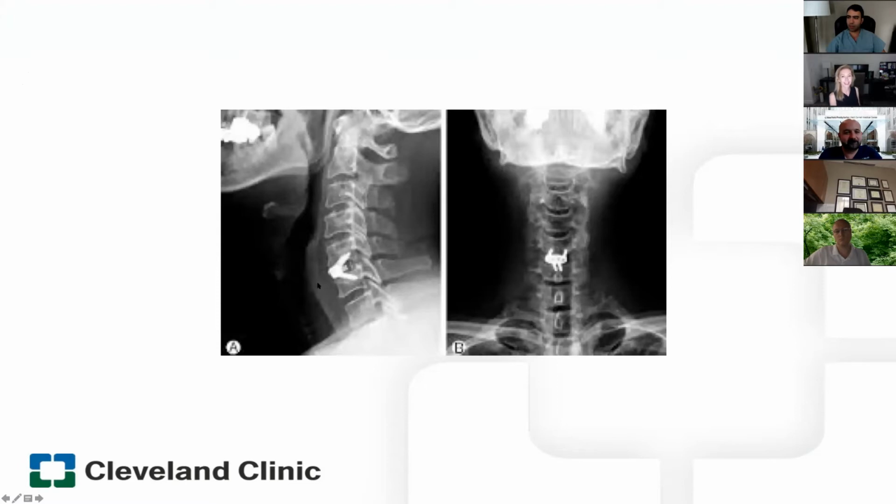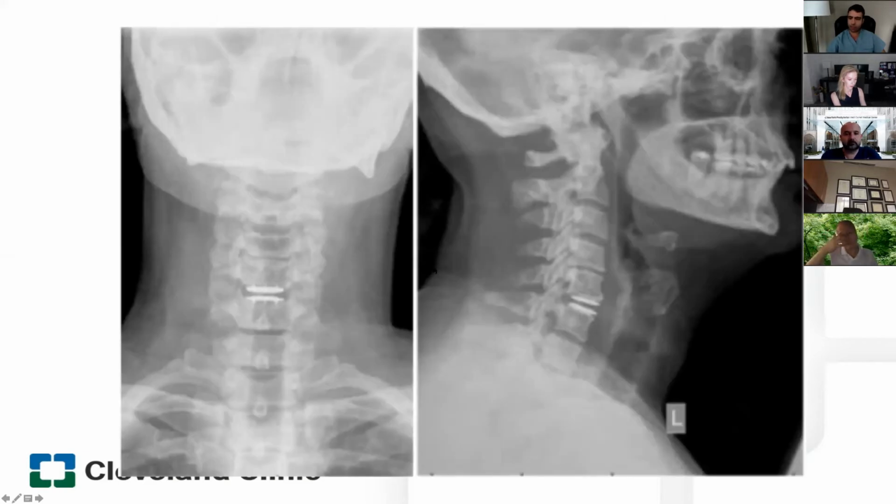I talked about standalone interbodies, right? These are the ones where you have the integrated screws. And the reason you don't have a plate here is, number one, it can sometimes be a little bit technically challenging for multi-level ACDFs to place a plate. And there are also considerations with preventing the plate from overlapping the adjacent disc space, either cranially or caudally, to prevent accelerated degenerative changes. Now, we discussed the possibility of doing an arthroplasty, okay?